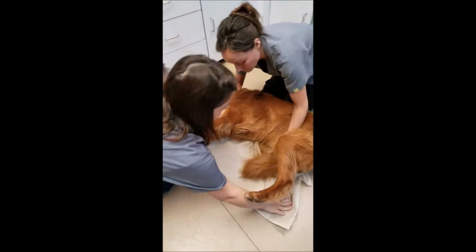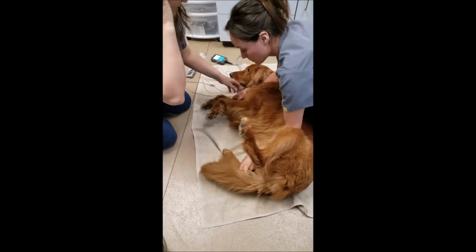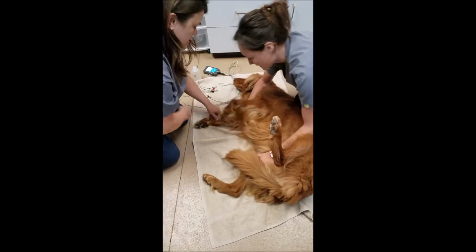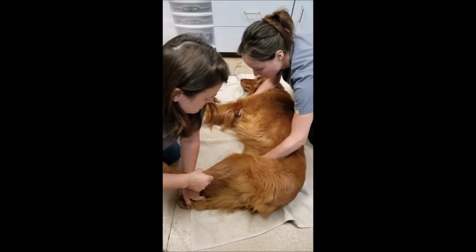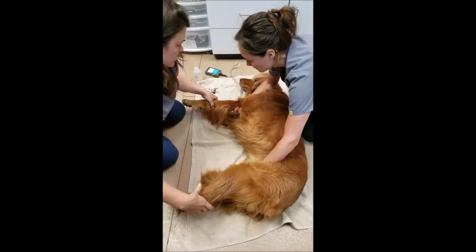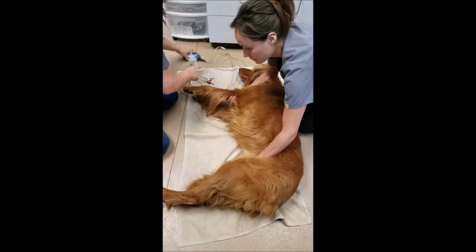Good boy. And then we'll make sure that his legs are perpendicular to his body. Okay, and then that they're not touching each other. And we're going to keep him as still as possible, and then we can start to attach our leads.